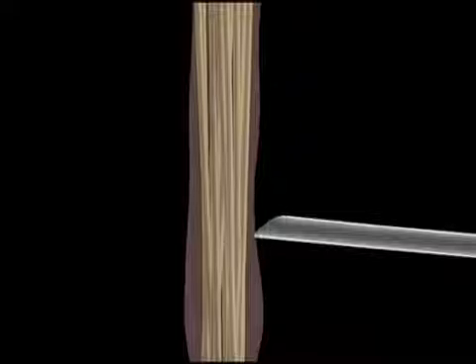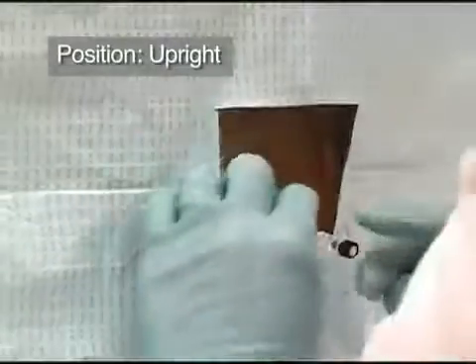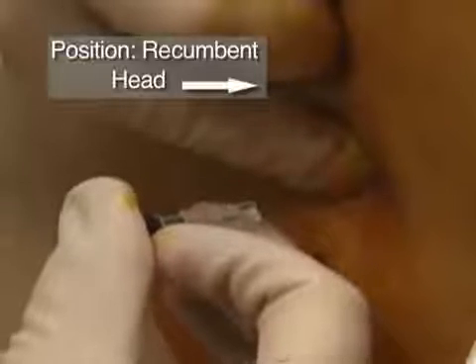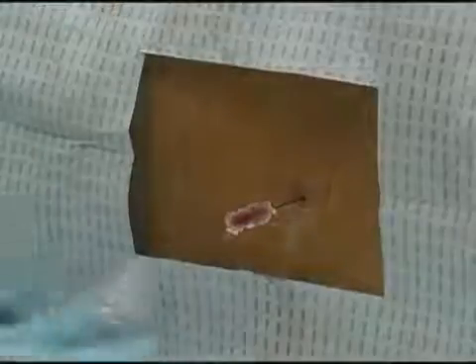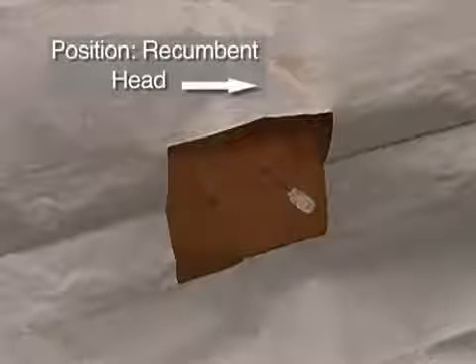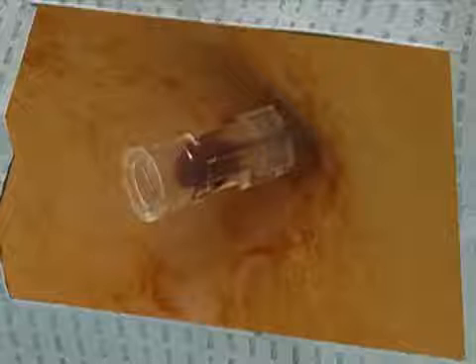As the needle passes through the ligamentum flavum, you may feel a popping sensation. Once you have reached this point, the needle should be advanced in 2 mm increments and the stylet withdrawn after each increment to check for CSF flow. If no fluid is detected and bone is encountered, withdraw the needle to the level of subcutaneous tissue without exiting the skin and redirect the needle. Fluid will flow once the needle enters the subarachnoid space. If the lumbar puncture is traumatic, the cerebrospinal fluid may be tinged with blood. As additional fluid accumulates, the fluid should become clear, unless the source of the blood is a subarachnoid hemorrhage. If the flow is poor, a nerve root may be obstructing the opening of the needle, and you should rotate the needle 90 degrees. If drops of blood enter the needle it may become clogged; in this case, obtain a new needle and enter the site through a different interspace.